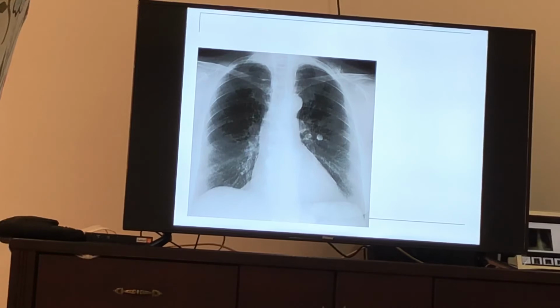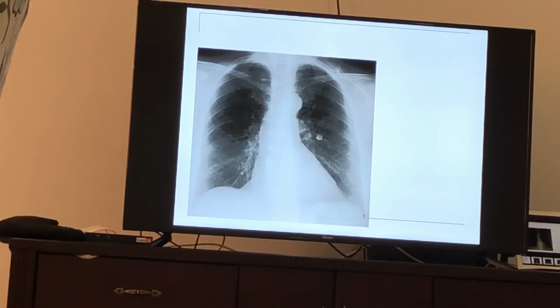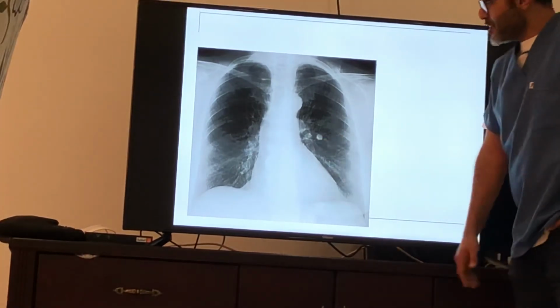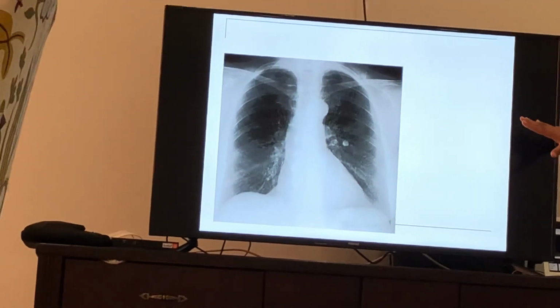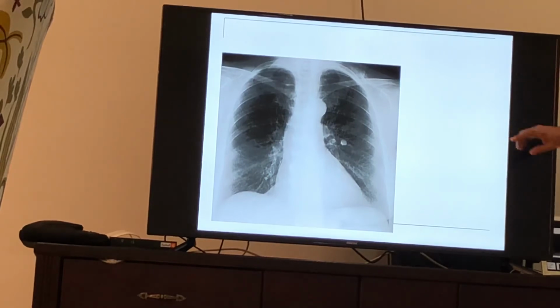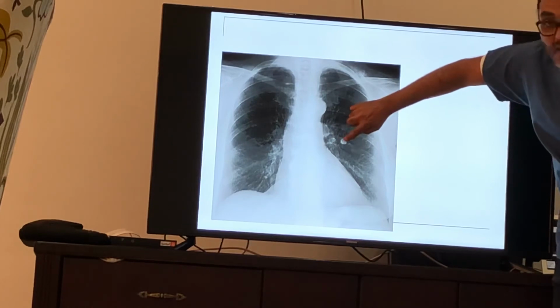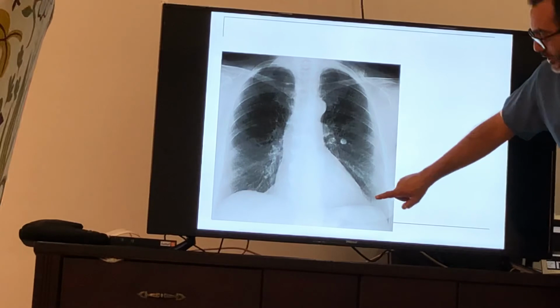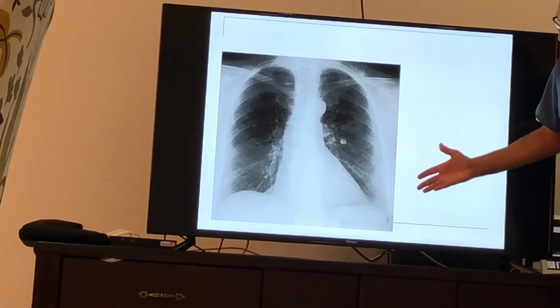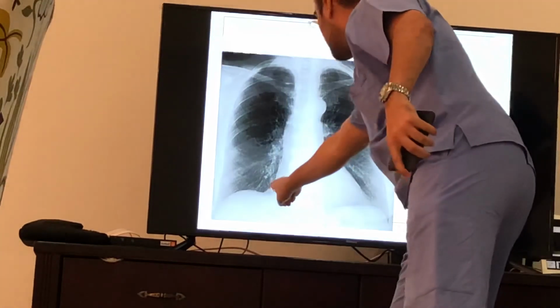What does this look like? This is what a nodule looks like, somewhere between 1 and 3 centimeters. There could also be extent of calcification. As you can see, it's more dense. There is something lower right that could be early nodular disease, possible, in the right lower position.